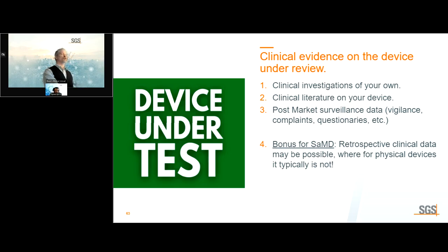So you have an additional, it's still the same type of data. It's not a new route to conformity, but you have an additional data stream that is available to software only that is considered clinical data. But what you really have to take into account very carefully is when in the workflow is the software used. If the software is used very midstream and what's happening with the patient in real time matters a lot, then the usability influences the flow of surgery in real time. Now retrospective data is very hard to pitch because how it is affecting the patient in real time, it may not be representative of clinical use.